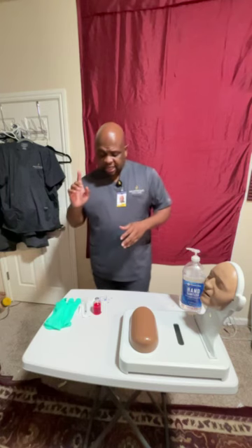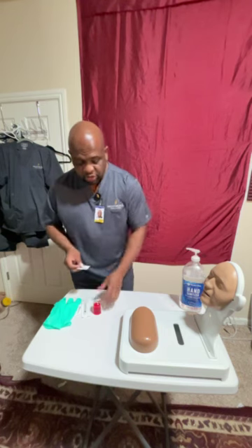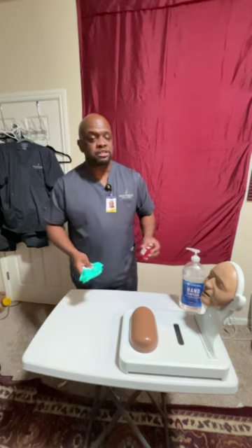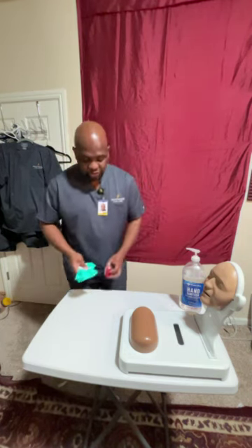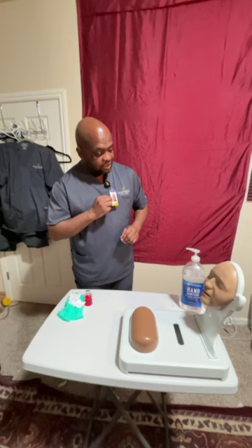Now, I will go ahead and gather my gloves, my syringe, my needle, gauze, and 2 alcohol wipes along with the morphine sulfate medication. I'll take my items to the patient's room. I will introduce myself to the patient, tell the patient why I'm here, and who I am. So knock on the door. Knock, knock. Hello, Mr. Jones. My name is Robert, student from Nightingale College.